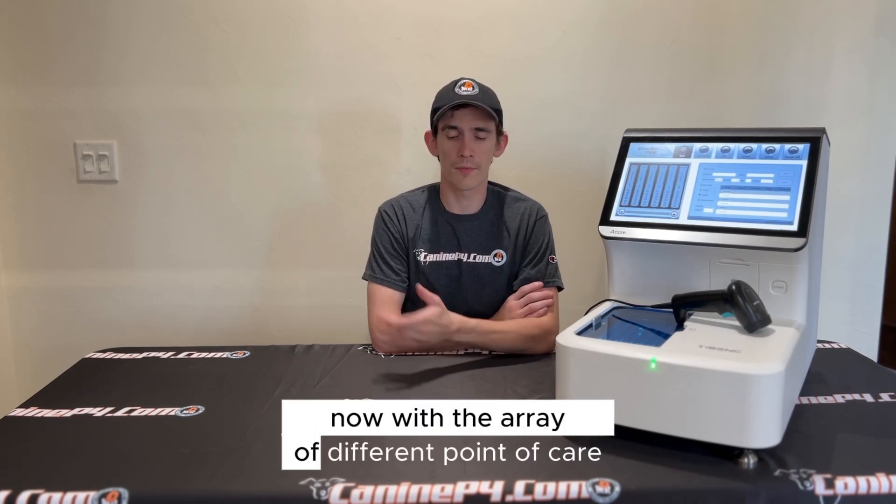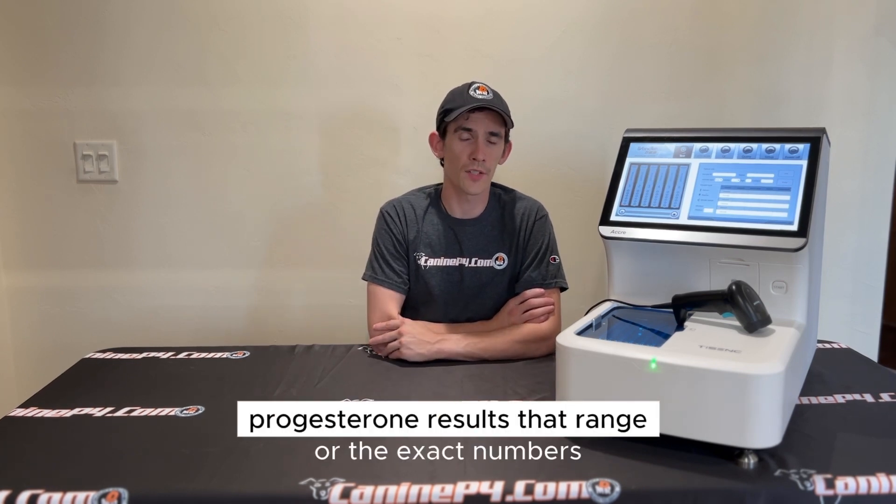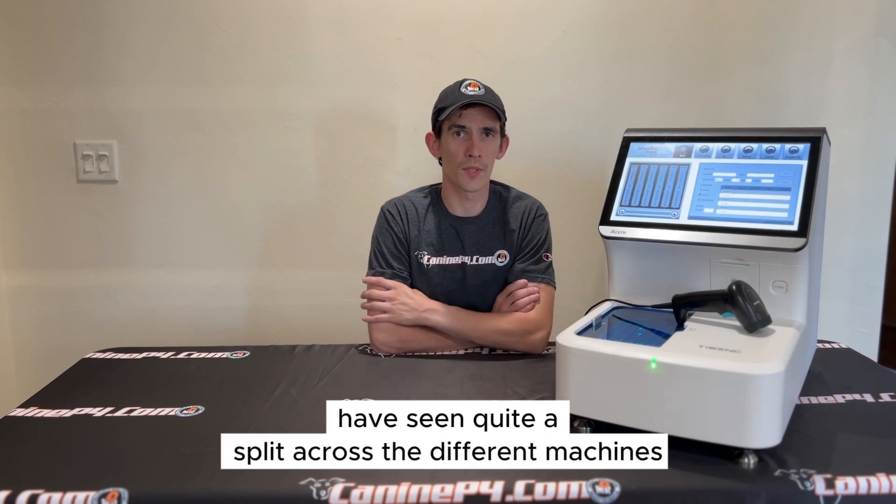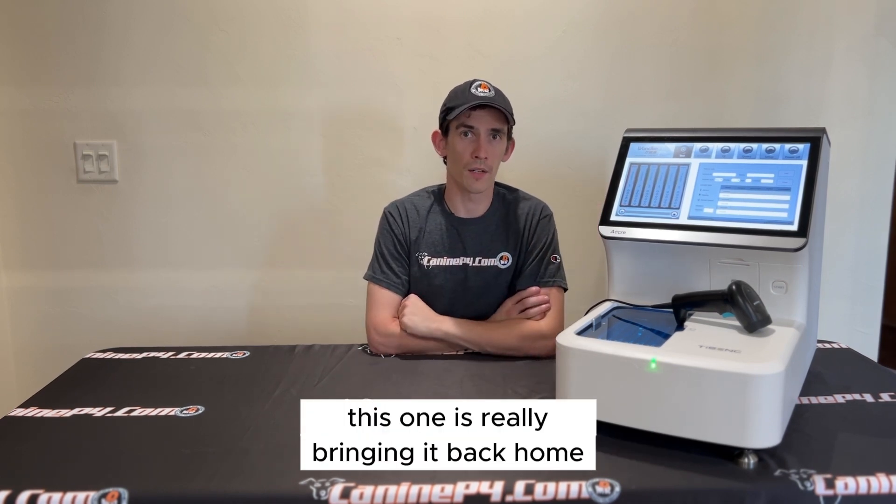With the array of different point-of-care progesterone analyzers, the exact numbers have seen quite a split across the different machines. The Acuri8 is really bringing it back in line with the gold standard.